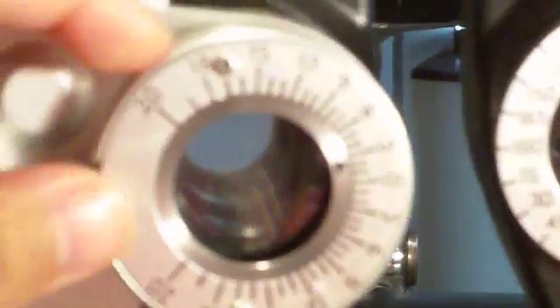After you're done with the final MPMVA on the left eye, we do what's called binocular balance. Binocular balance is the concept of having your eyes working together and making sure that the images are on the retina at the same time. During binocular balance you open both eyes, but we put dissociating prisms in front of the eyes. A prism is put in front of each eye to make two images, so you're seeing double — which is completely normal. You compare the two images, and if they're both equally clear then your binocular balance is balanced. If one is much clearer than the other, you adjust the prescription until they're balanced, then remove the prisms and the patient will see one image again.